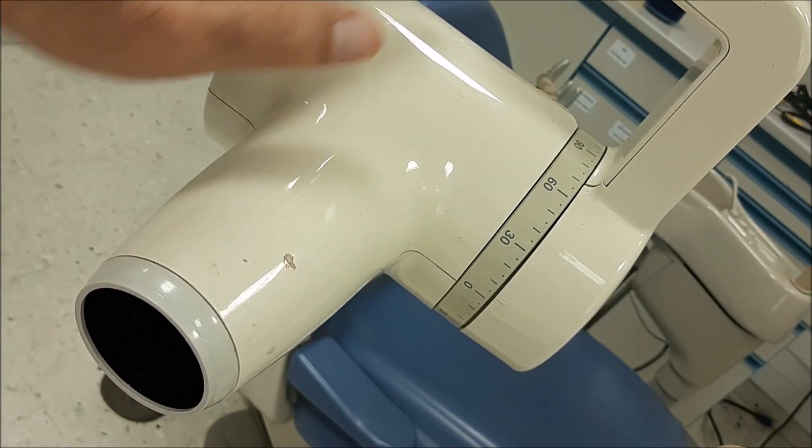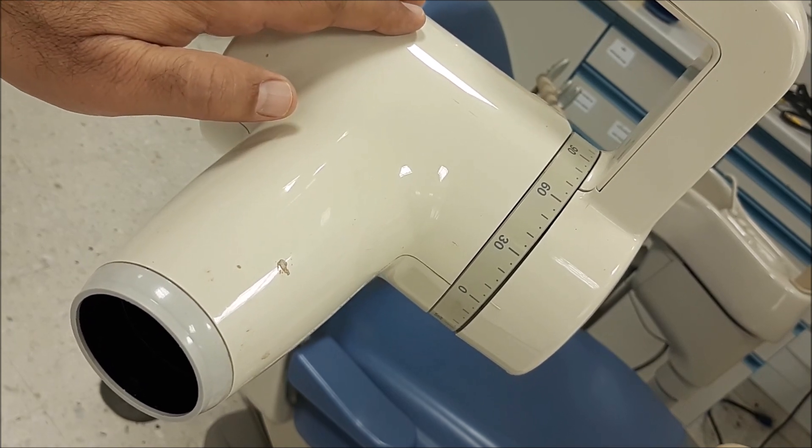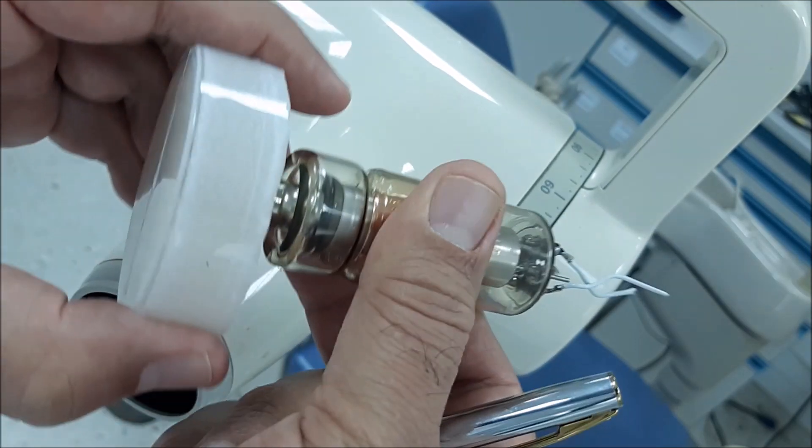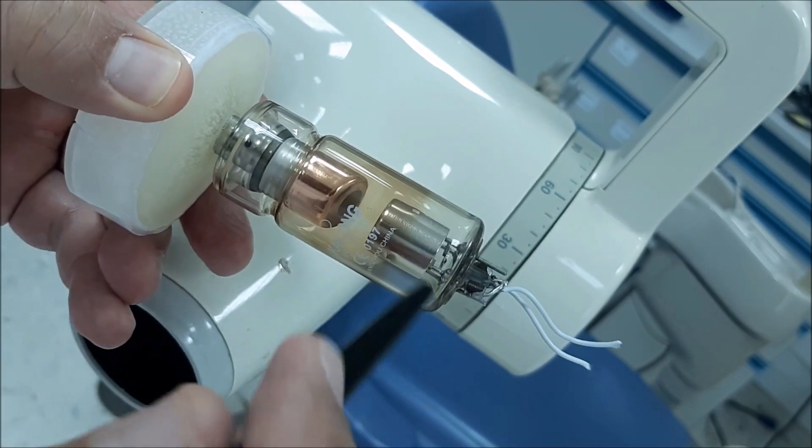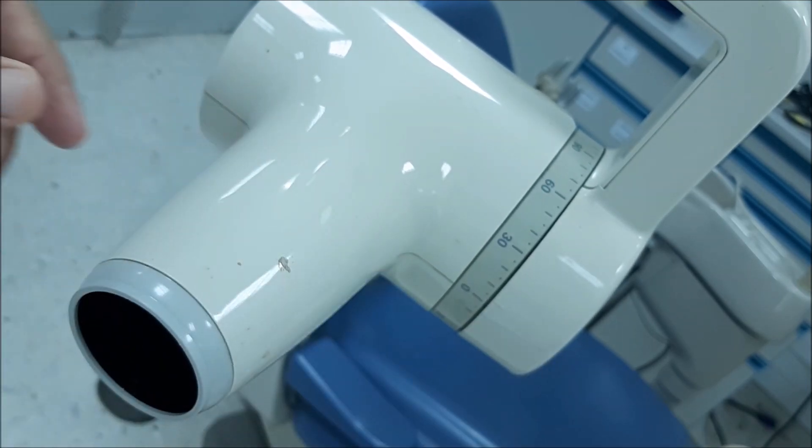Inside here there is a step-up transformer and a step-down transformer. The step-down transformer heats up the tungsten filament, while the step-up transformer creates potential difference between the cathode and the anode.